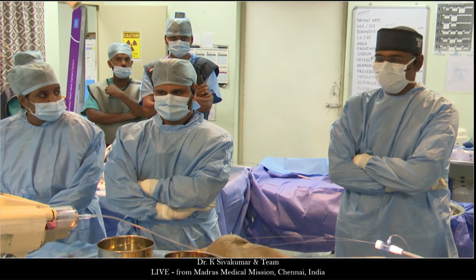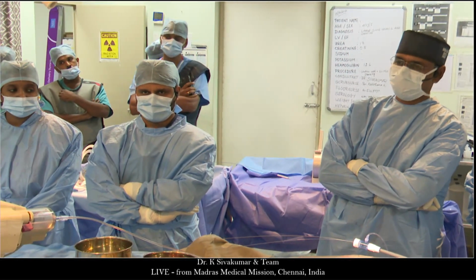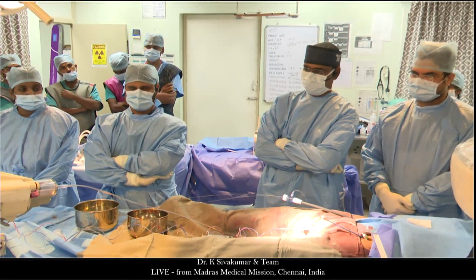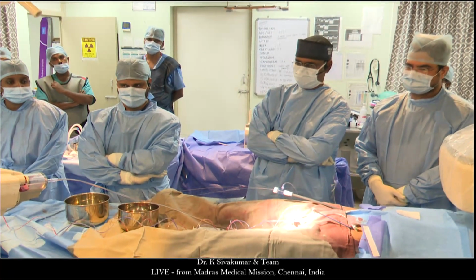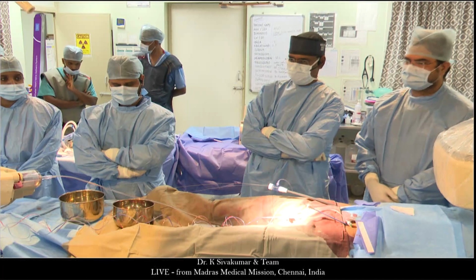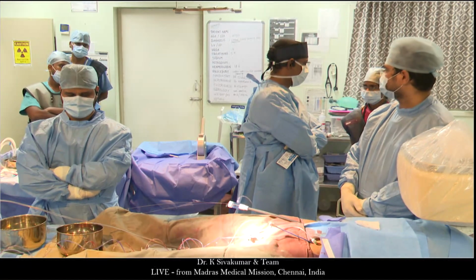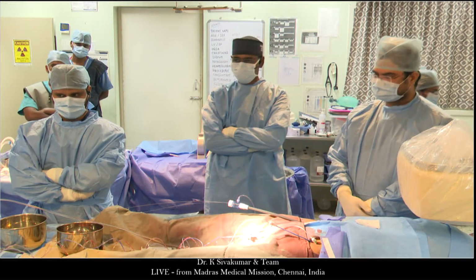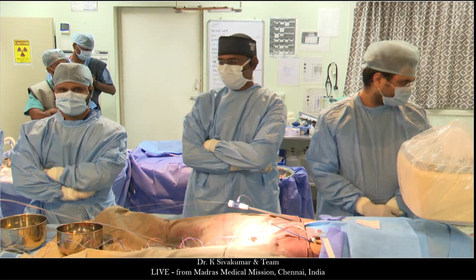So, Sivakumar, I'm going to open this case for discussion. On the panel here, Alpai, in your center, would you do this transcatheter or surgical because of this additional anomalous vein? At this age, I think maybe we can do a transcatheter approach because it's an older age, but I am not sure in the adolescents, in small kids, such as below 16, 17 years old. So you're worried about the age of the patient? Yeah, the age is good because in smaller age, I am a little bit concerned.